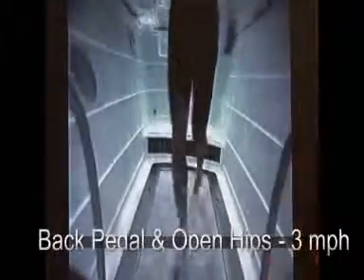The pool I have has video with instant feedback. If I want them to go through a specific range of motion, and they're not toeing off far enough with a high ankle sprain, or they're not externally rotating their hip as much as I want, I can see right away that they're not doing it. They can look at the TV in front of them and understand what I want.